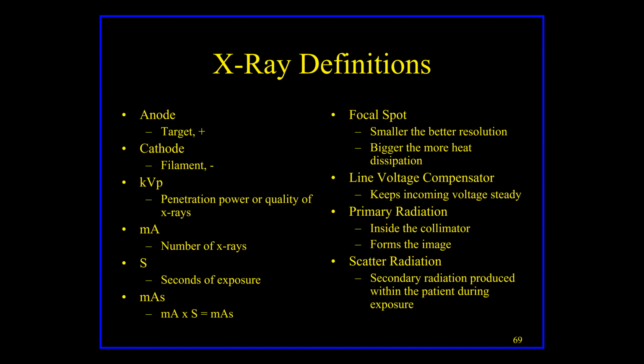So just a few things. Inside the X-ray tube, there are different parts, and this lists some of the parts and some of the definitions that we probably need to know. One part of the X-ray tube is called the target, and that is actually where the X-rays.